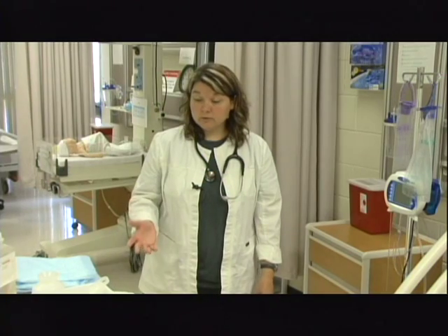So now I'm going to talk to you about actually discontinuing the NG tube. So as I'm outside the patient's room, I always need to verify the order that says that the NG tube should be discontinued, and I need to make sure I'm correlating that with the patient's presentation and assessments.